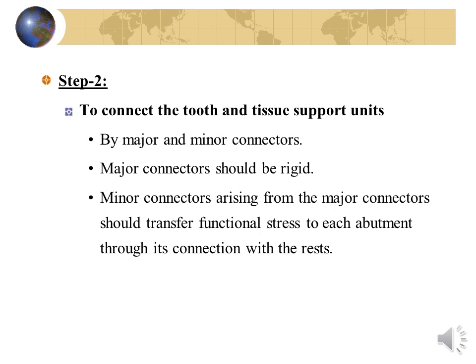Designing and locating major and minor connectors in compliance with the basic principles and concepts. The major connector must be rigid so that forces applied to any portion of the denture can be effectively distributed to the supporting structures. Minor connectors arising from the major connector should transfer functional stress to each abutment tooth through its connection to the corresponding rest.